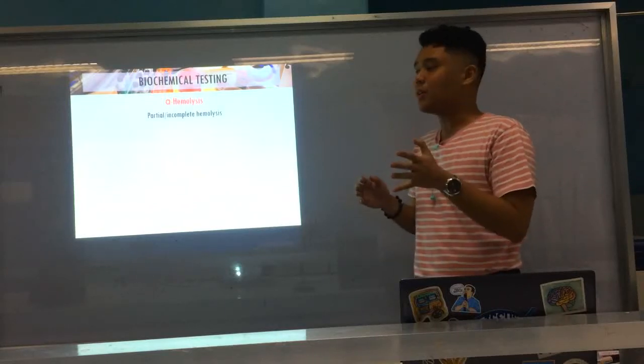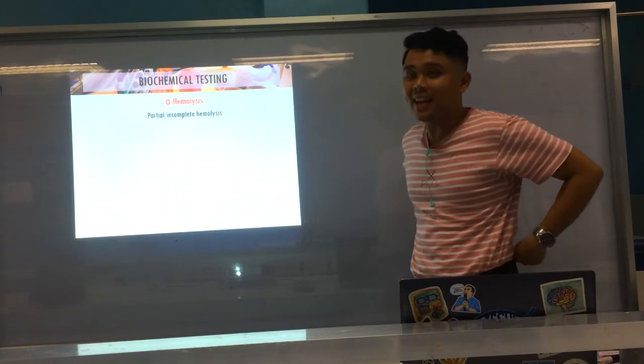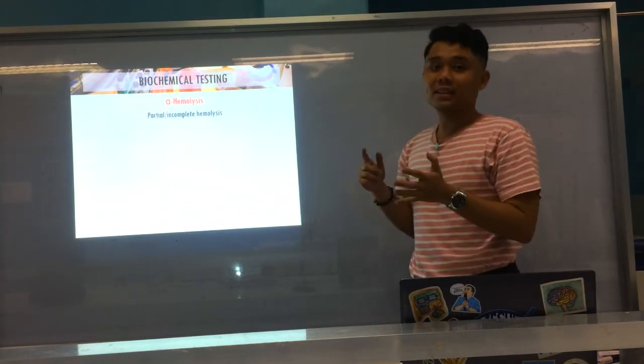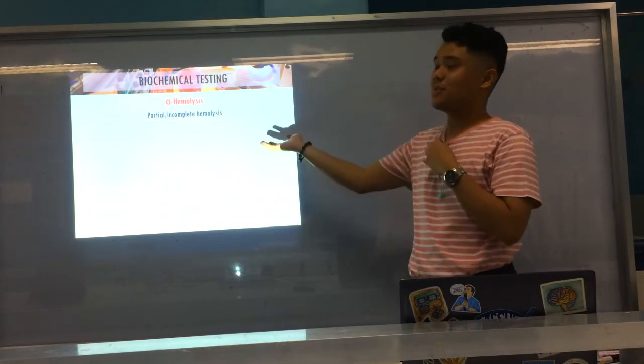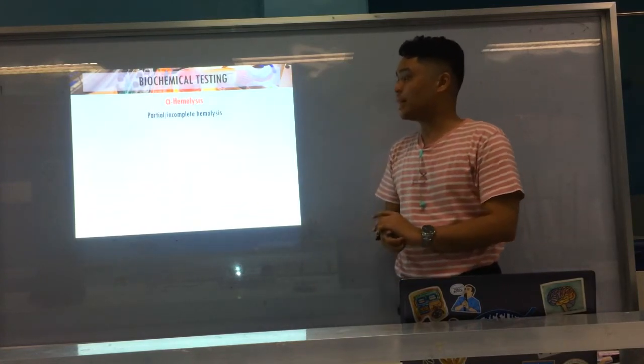Okay, all right. So now we'll go to the second part of our video on catalase-negative gram-positive cocci and their biochemical testing. We'll now start with alpha hemolysis, the partial or incomplete hemolysis, after having gone through beta.